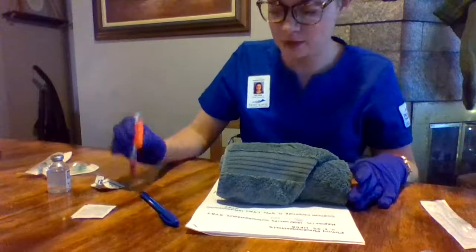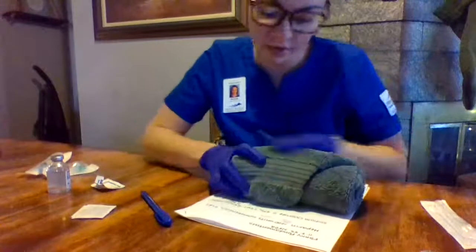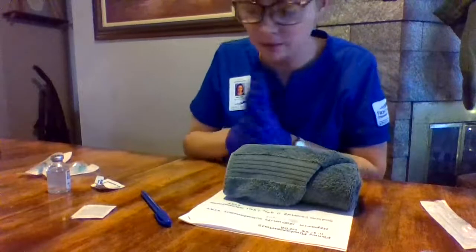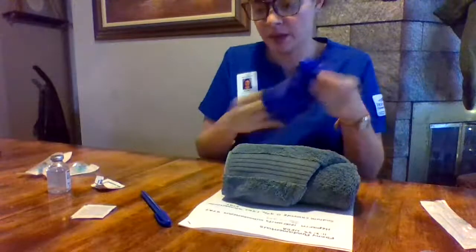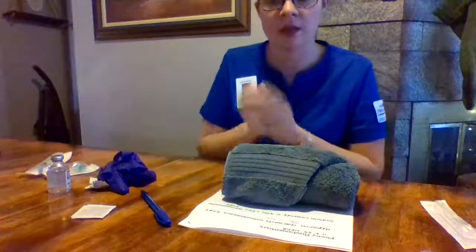Cap it and dispose of it in the sharps bin. Then I will check the injection site for any oozing or bleeding. If there was any, I would put a small gauze pad on it. Then I will take off my gloves, wash my hands, and I'm finished.